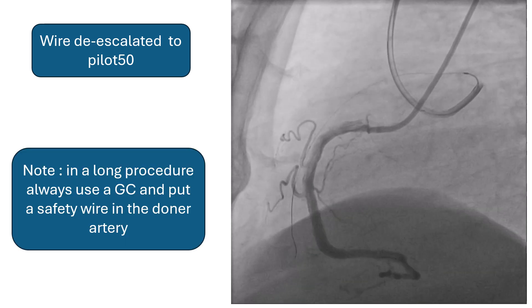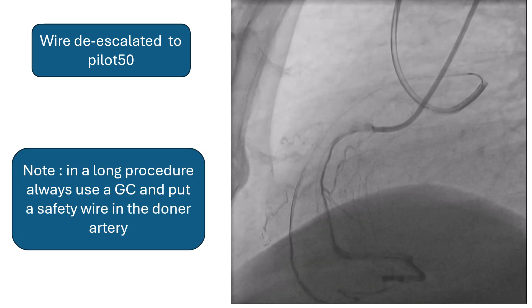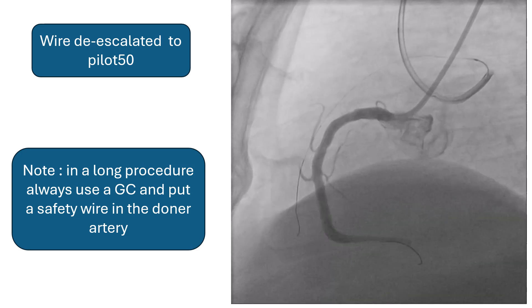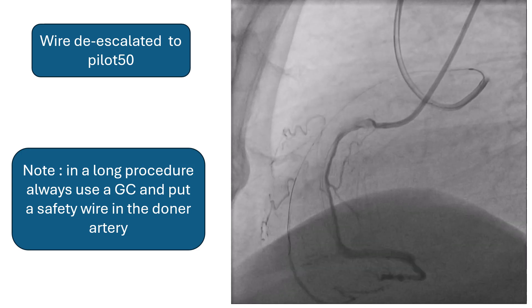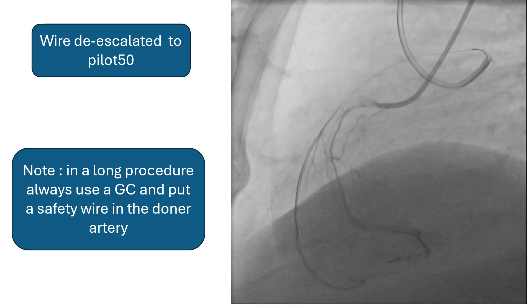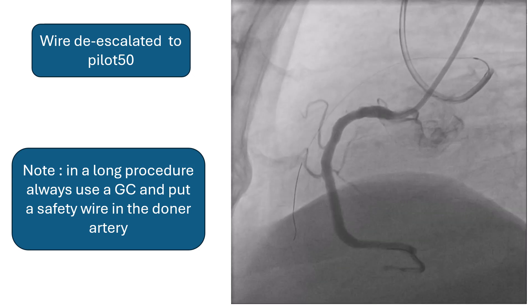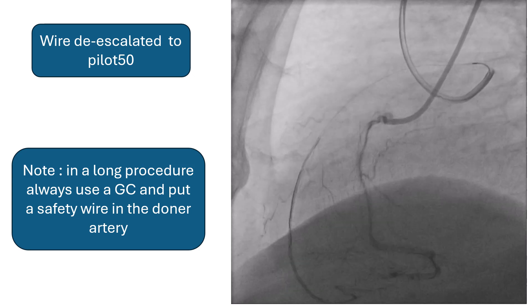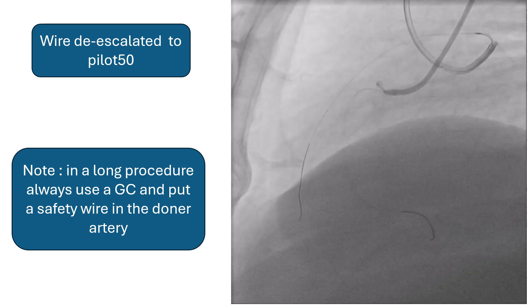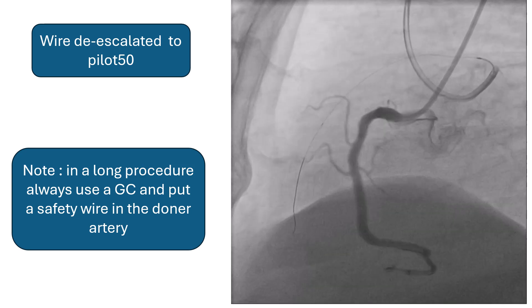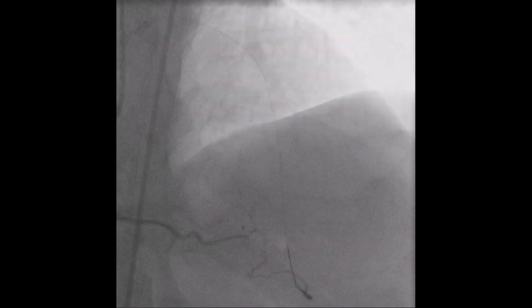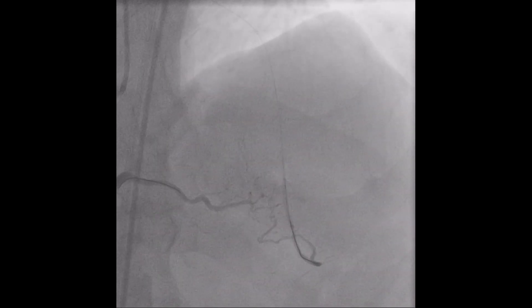A note about dual injection: in a long procedure, always use a guiding catheter and put a safety wire in the donor vessel, so that if anything happens you have enough time to pass a balloon or a stent to treat any dissection in the donor vessel. This is another review to confirm the intraluminal course of the wire.